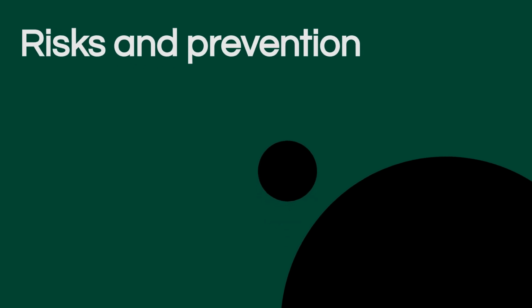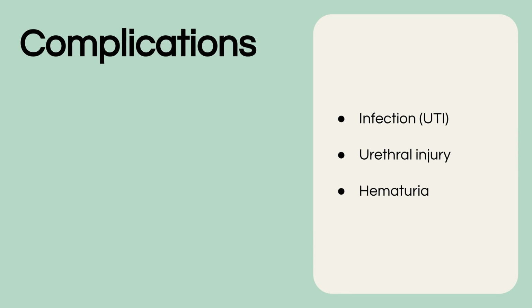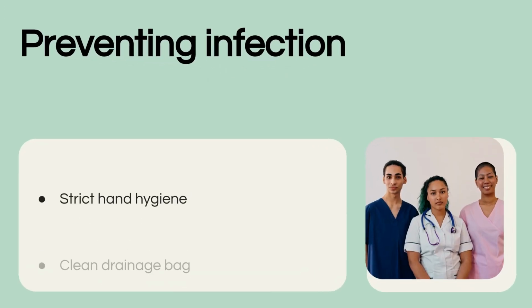Understanding the risks and complications associated with catheterization allows us to take proper precautions. The most common risks include infection, which can lead to sepsis, urethral injury, skin breakdown, and, rarely, long-term risks like bladder cancer. Prevention is key.